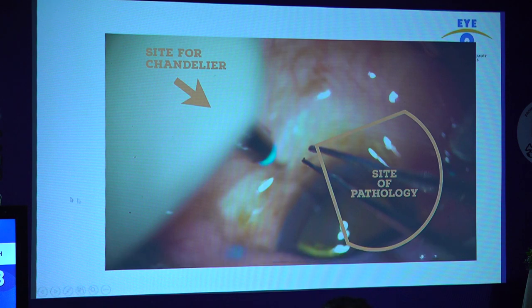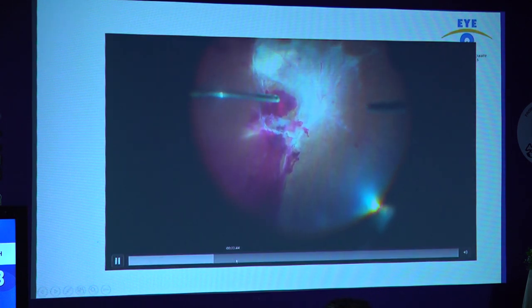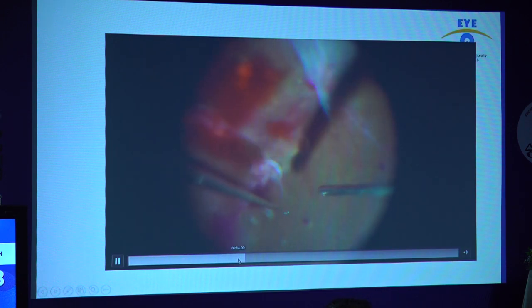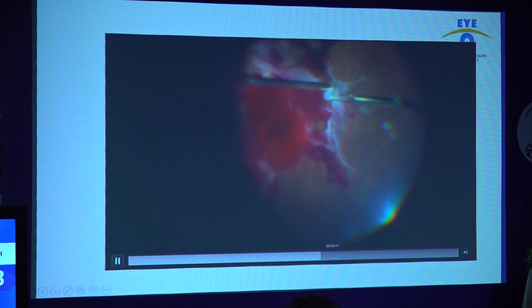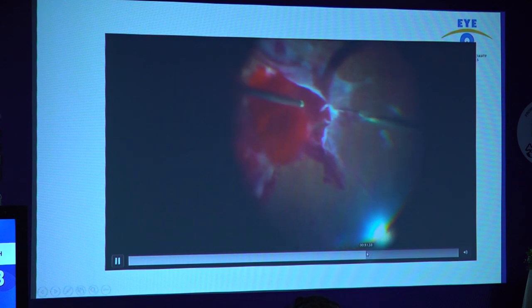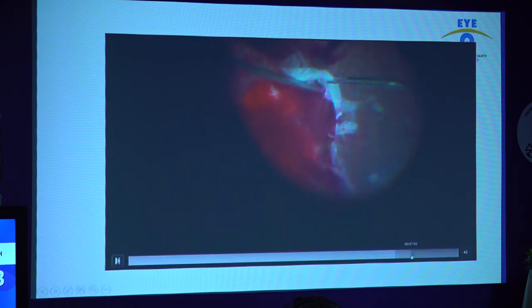So the rest is the same. I think all our VR colleagues are now addressing these. Similarly, we don't try to peel these neovascular complexes, we just segment and break them into multiple small islands. And the disc is often a good point where you will always find a plane. So that's the only area where we can peel off and create a plane and then start segmenting again.